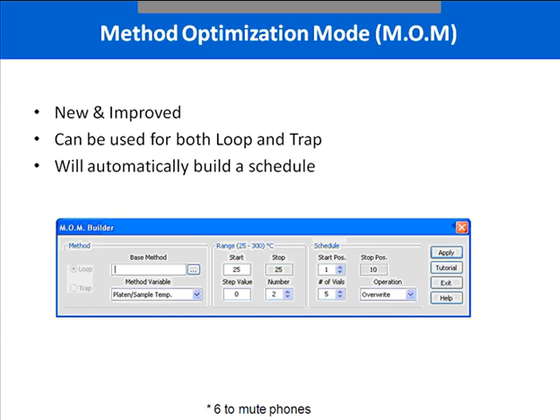The HT3 has a software function called the MOM — Method Optimization Mode. When a certain technique or list of target compounds is new and needs method development or fine-tuning, this is where you'd use MOM. Method parameter optimization can be performed quite easily through its use. This is a new and improved feature of the HT3. It can be used for both the trap or loop modes of the instrument, and both modes can be used at the same time within a single schedule. MOM offers a quick and easy way to automatically build the schedule without having to create 10 or 15 different methods for each parameter change.